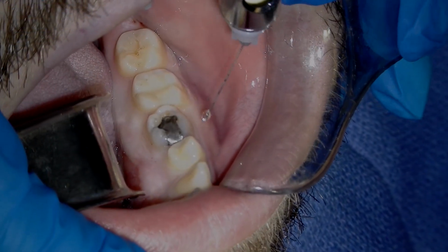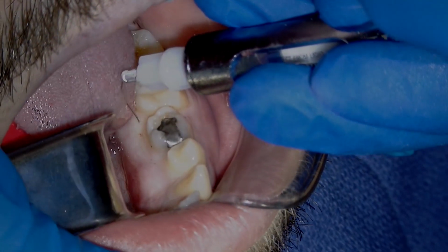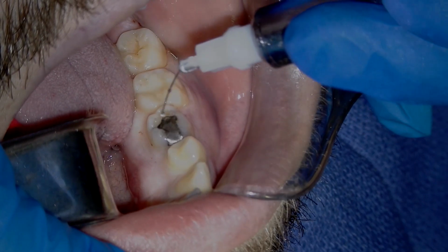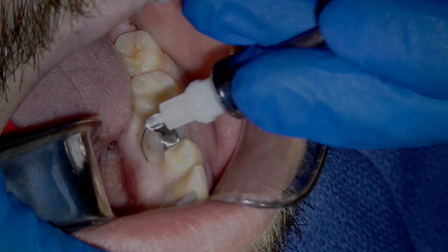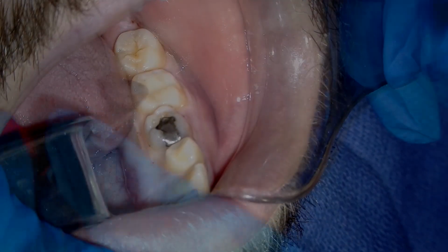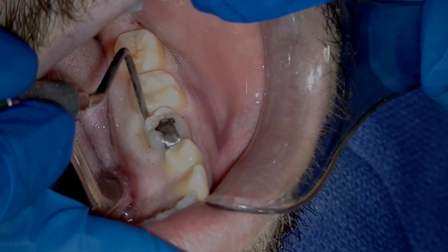Now, I want you to look at the amount of keratinized tissue here and the width of his ridge as I numb him up. We got plenty of room to work with. Nice attached tissue on buccal and lingual, and a nice wide ridge. Now, my technique to extract this tooth is I'm just taking an instrument to separate the tooth from the attached tissue.